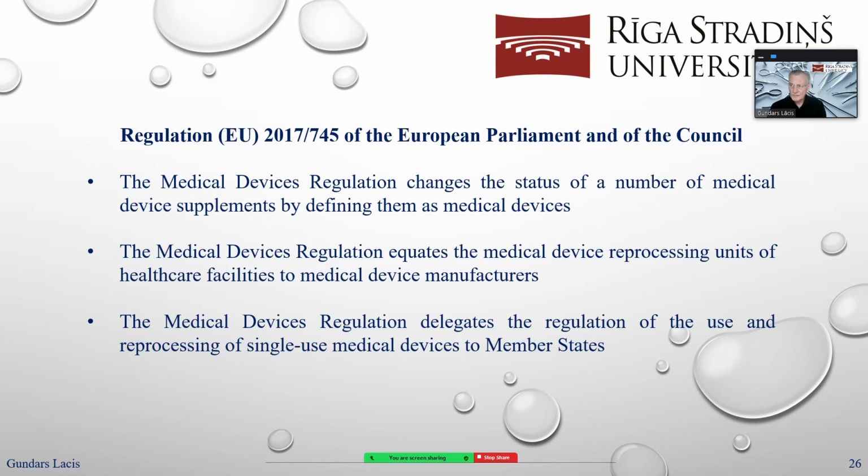It means that every country can decide whether to allow reprocessing and reuse or not. Of course, this regulation lists a lot of points to follow to reprocess and reuse those medical devices, but every country can decide: is it possible for us or not?